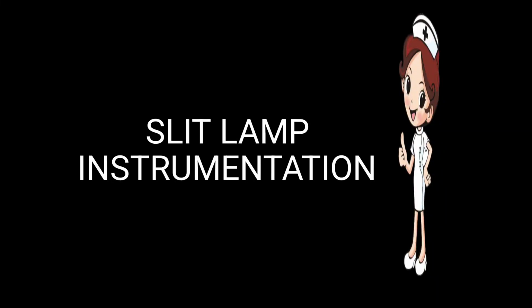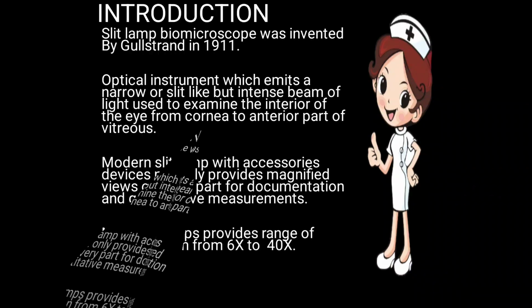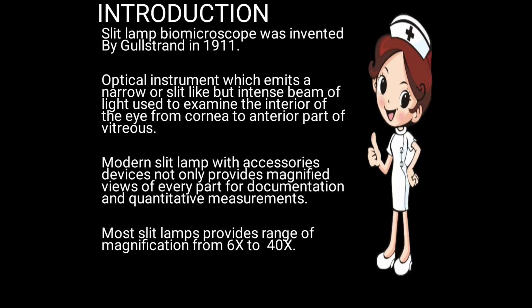Hi everyone, today I am giving you information on the topic slit lamp instrumentation. So let's move to its introduction. The slit lamp biomicroscope was invented by Gullstrand in 1911. He was a scientist in 1911.